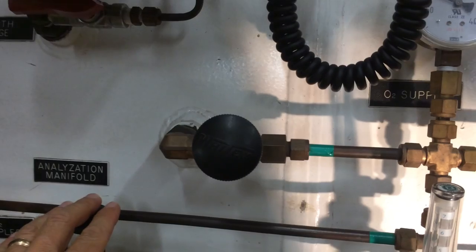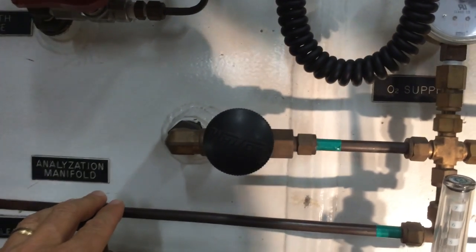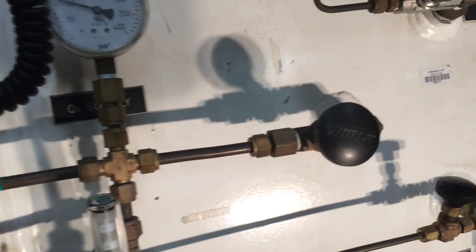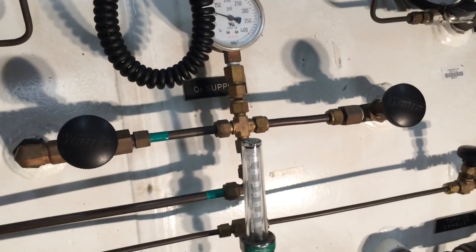Here are slow-opening needle valves, which are required any time we use oxygen. We don't want quarter-turn ball valves with oxygen because that would cause sudden increases of pressure inside the chamber. So the oxygen is delivered inside via these needle valves.